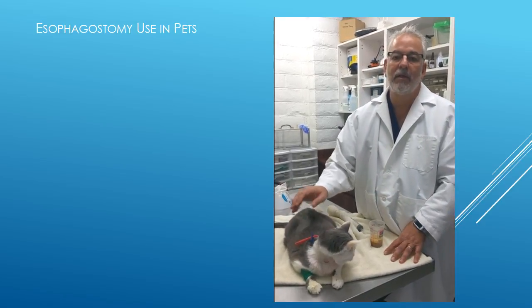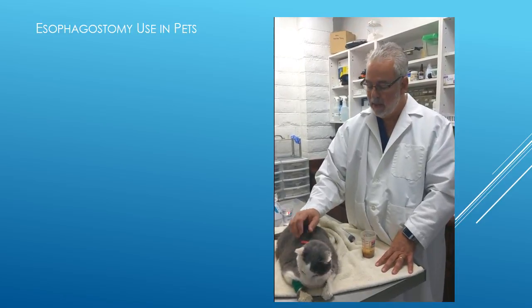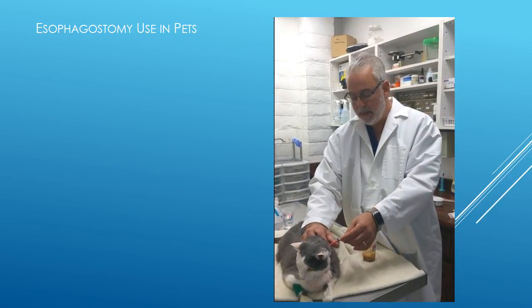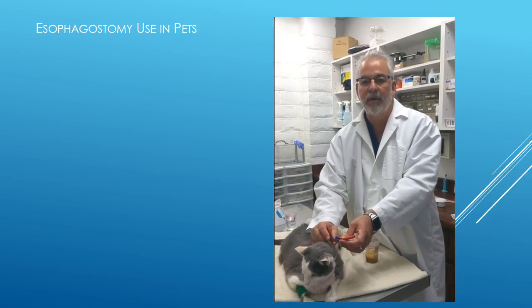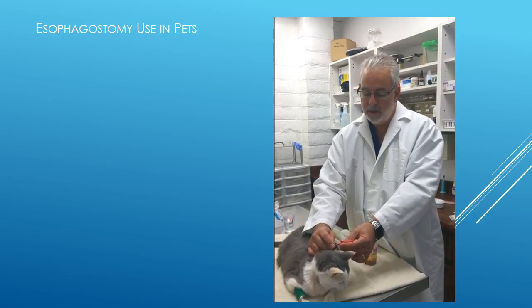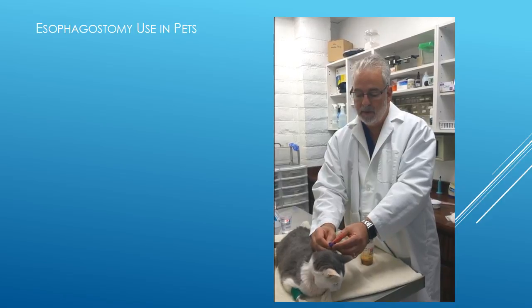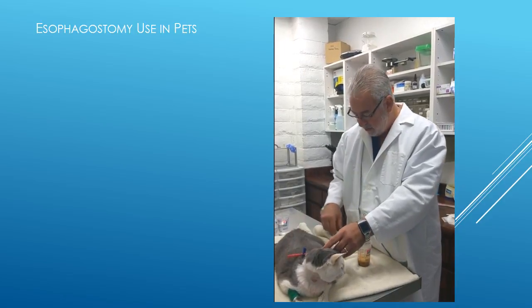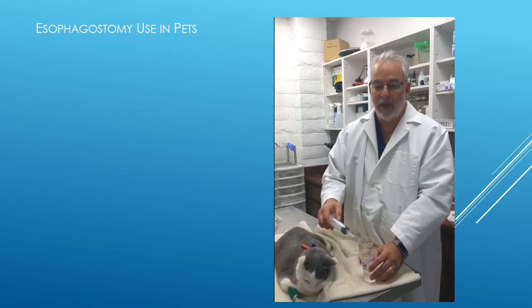Most cats tolerate this very well, and rarely do we have problems with them trying to scratch it out. You may notice on our tube here that we have a little clip that keeps the tube tight to prevent any fluid from coming back up after we've used it. So when you're going to use this, you have to move the clip off the rubber tube to allow it to be open. Before each time we use this tube, we're going to use some fresh warm water to flush out the tube.